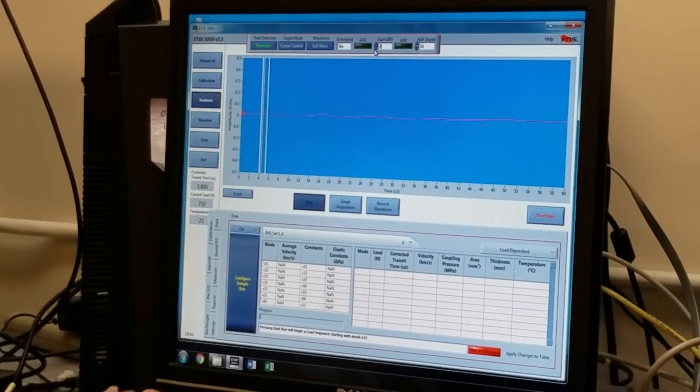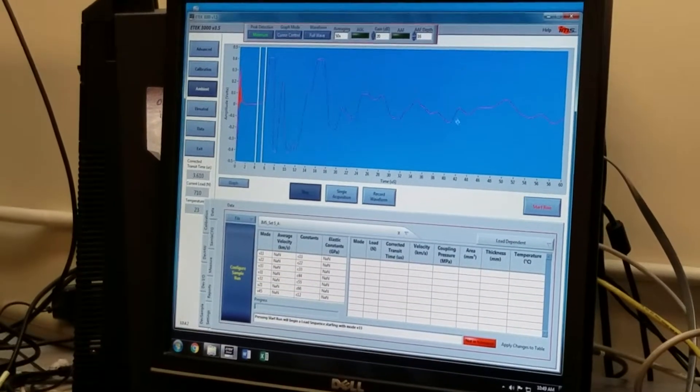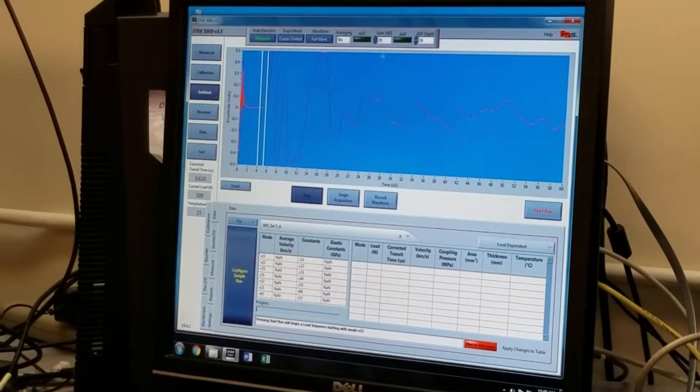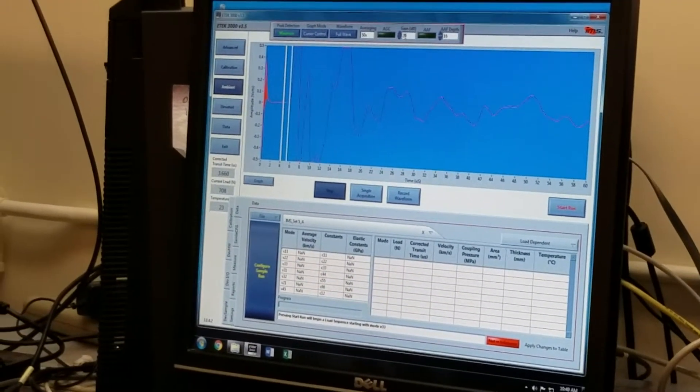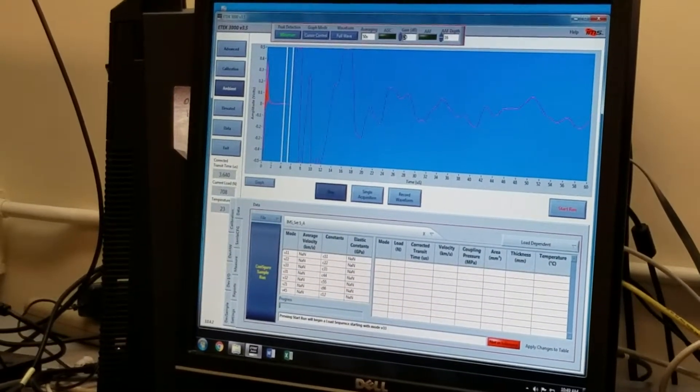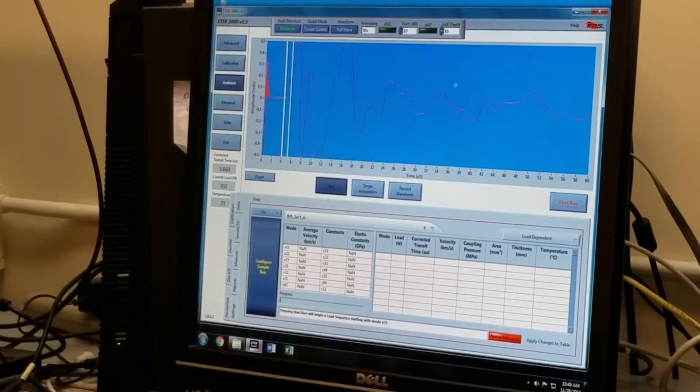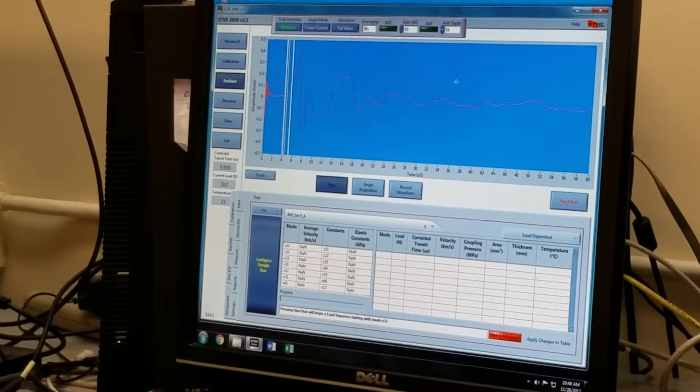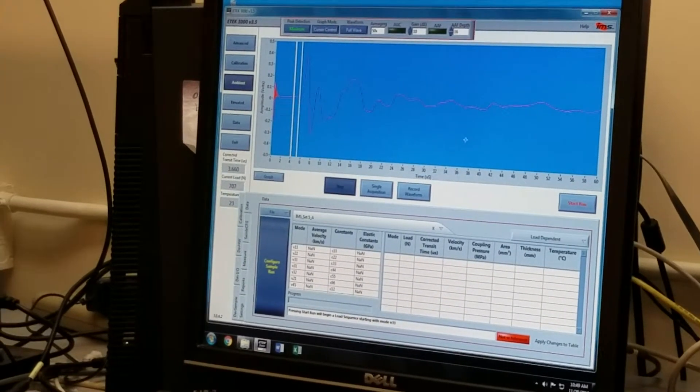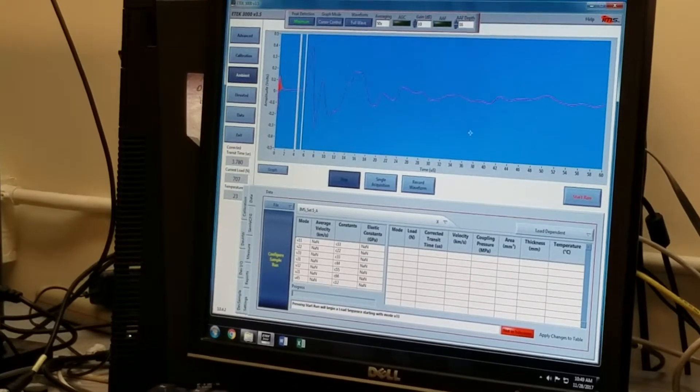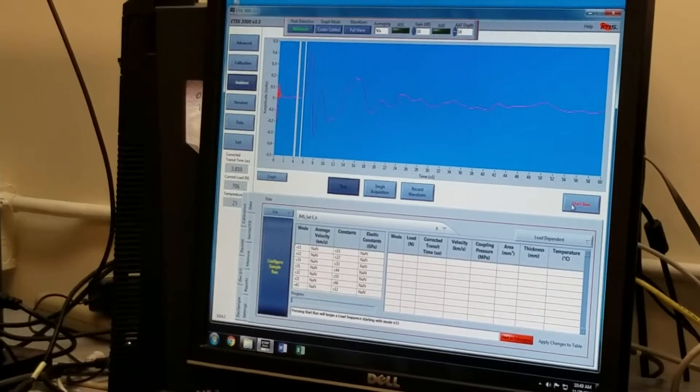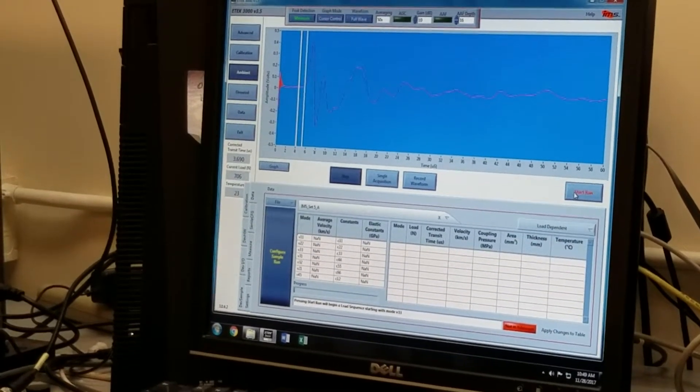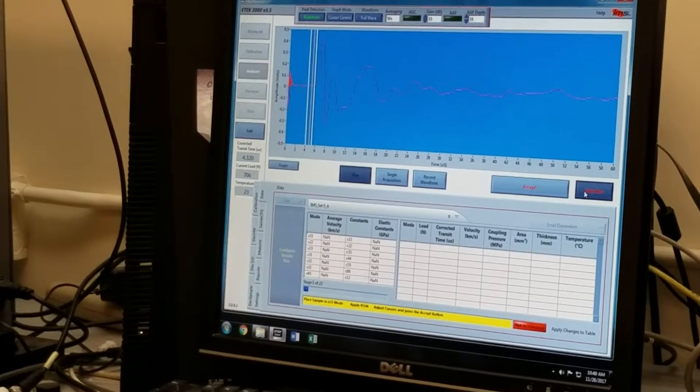I'm going to need to increase my gain. Typically, I like to have a waveform that is on the order of 3 to 4 tenths of a volt in size. This is a longitudinal waveform. I'm going to also click start run now that I have my sample in place.